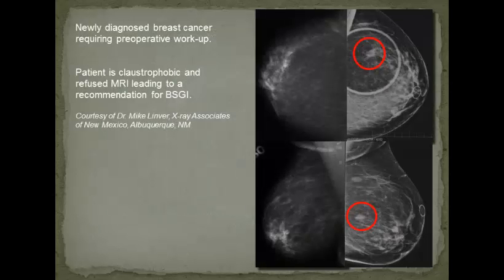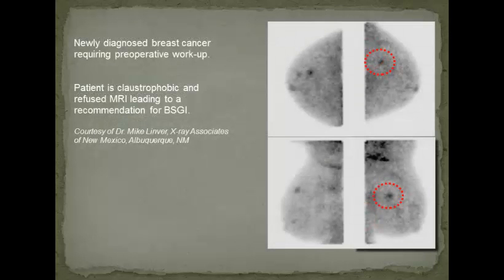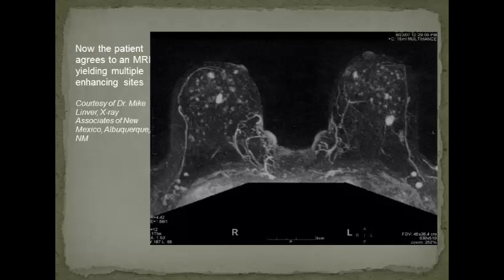This is a patient who has an obvious spiculated mass. Not much question about that, but she has some other appearances in her breast tissue bilaterally. There's the known mass on the molecular breast imaging. And then what we see here are 2 additional foci contralateral to that. And with this, the patient initially refused an MRI. That was the reason they did the molecular breast imaging technique. And then she did this, and they convinced her to be sedated and undergo the MRI.